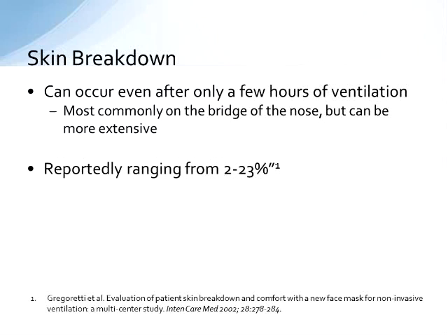Skin breakdown can happen pretty doggone quickly, as rapidly as a few hours of ventilation for those patients that are at high risk for developing a pressure ulcer, particularly across the bridge of the nose, but it can certainly be more extensive than that. If you're using nasal prongs or nasal pillows, you have to be cautious of the septum as well. The reported occurrence of skin breakdown in non-invasive ventilation, if you look at the literature, is anywhere between 2 and 23%. So that's a pretty wide range of occurrence there.